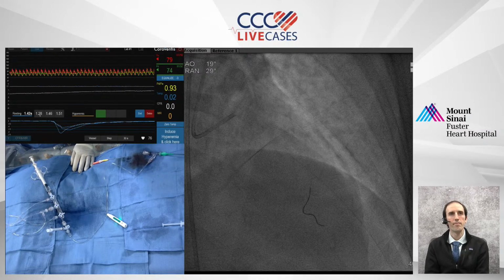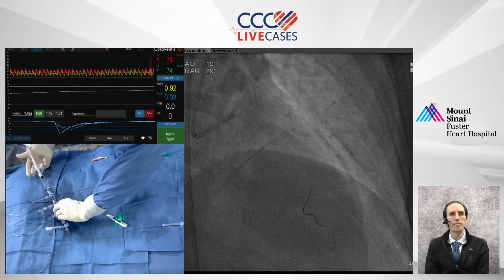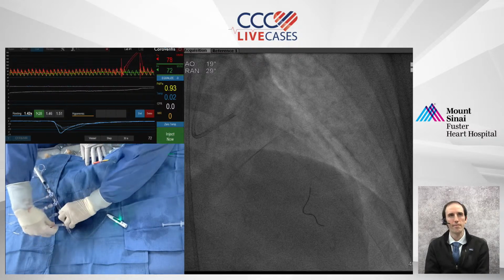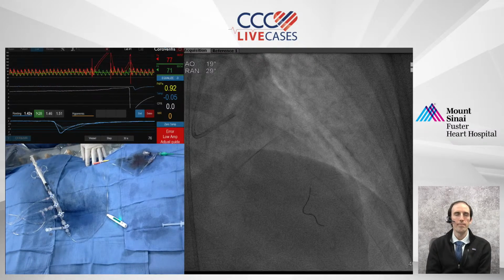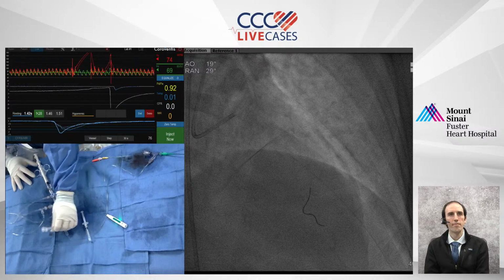So I'm going to repeat the 1.2 one more time. Is that the guide or not? No, I think we're okay. You can take that one out. Now I see it's a very brisk injection. Yeah, it has to be a brisk injection. You don't want to do it slowly.